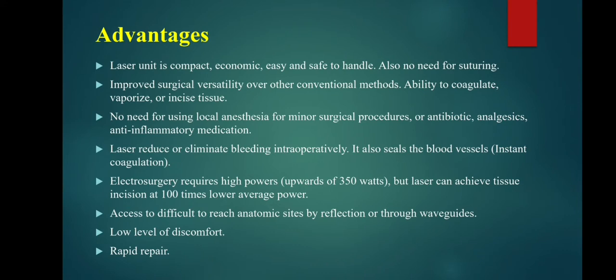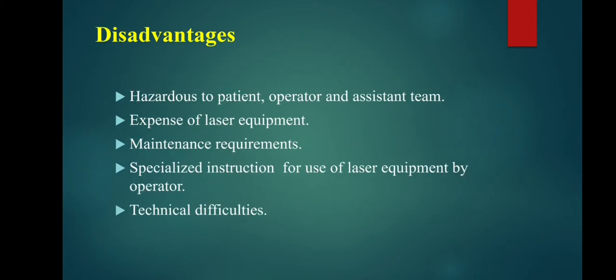Advantages of laser. Laser unit is compact, economic, easy and safe to handle, also no need for suturing. Improved surgical versatility over conventional methods. Ability to coagulate, vaporize or incise tissue. No need for local anesthetics or antibiotics, analgesics or anti-inflammatory medication. Laser reduces or eliminates bleeding. It also seals the blood vessels. Electrosurgery requires high powers, but laser can achieve tissue incision at 100 times lower average power. Low level of discomfort, rapid repair.